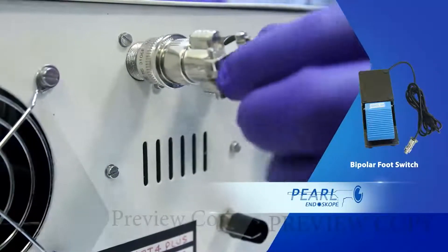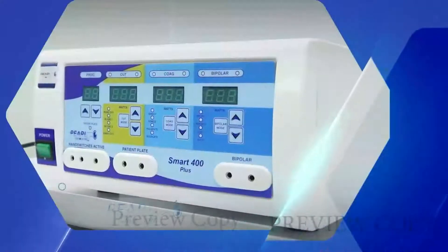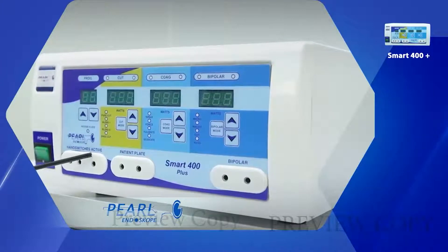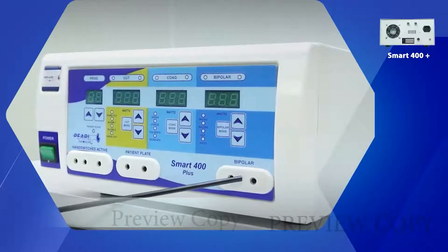Slightly rotate to secure the cable. This is the power switch, the hand switch, and the active connection. This is the patient plate connection port and the bipolar cable connection port.